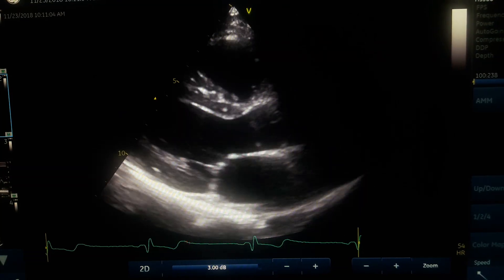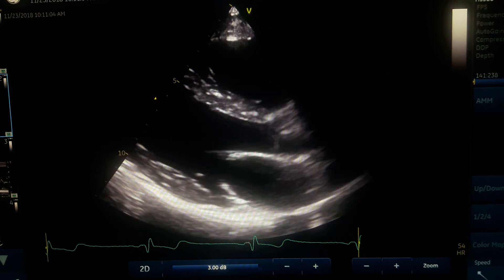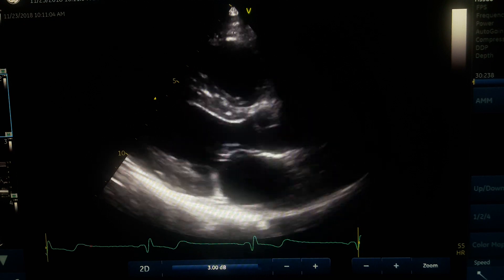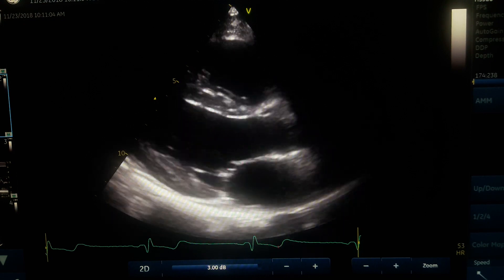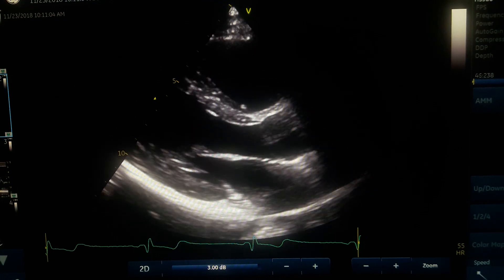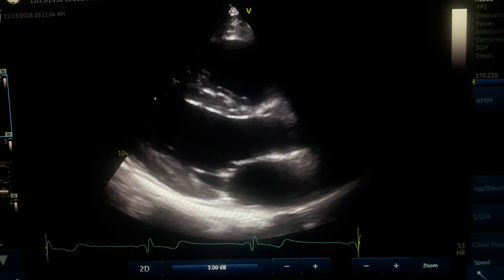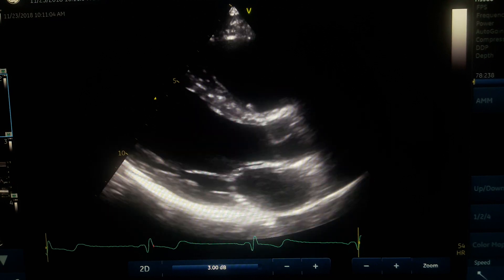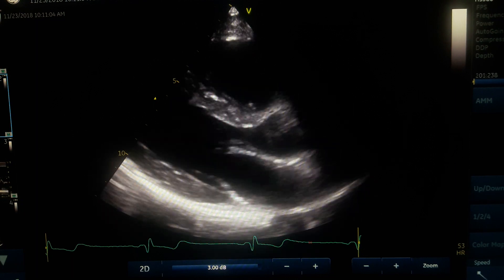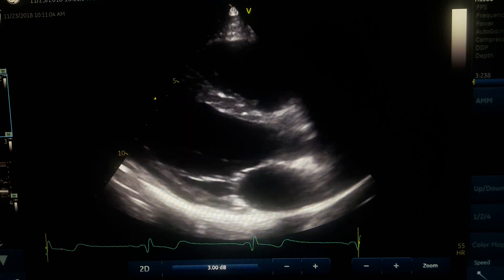Welcome to mastering guidelines in ultrasound and echo 2D measurement in parasternal window. Today we are going to talk about 2D measurement on parasternal long axis and short axis. On long axis, we have three types of measurement: left ventricular and wall thickness, mitral valve movement, and aortic cusp and aortic root, LVOT, and left atrium.